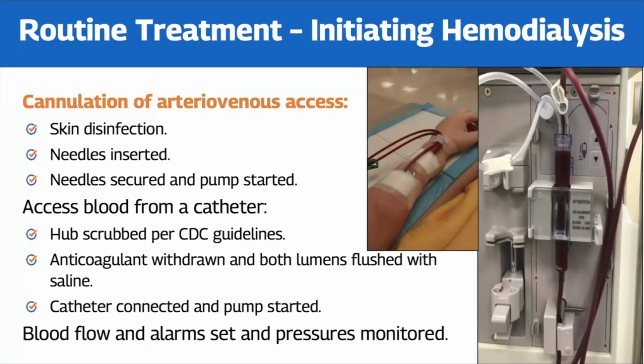The needles are secured with tape, and you can see the patient in the picture here has their needles in with gauze over the tape. It's always good to put gauze there so we can see any oozing of blood and know that there may be a problem with that needle.